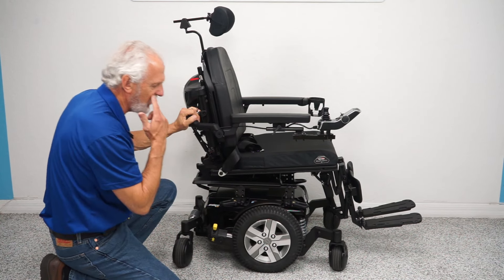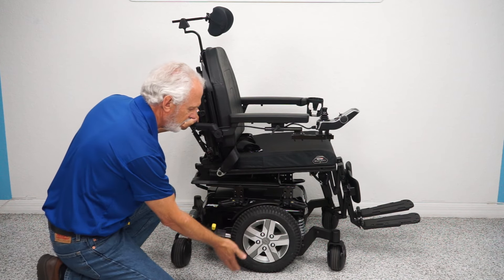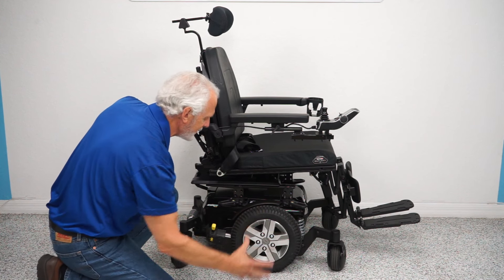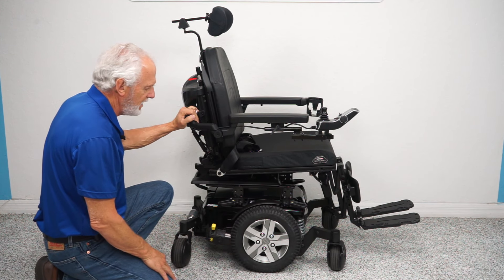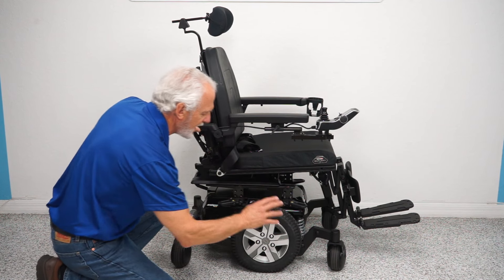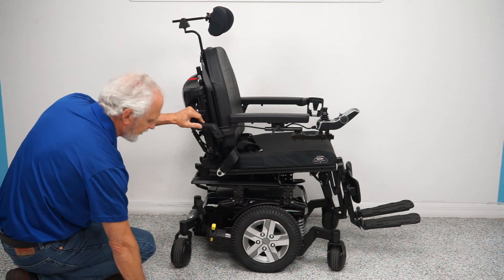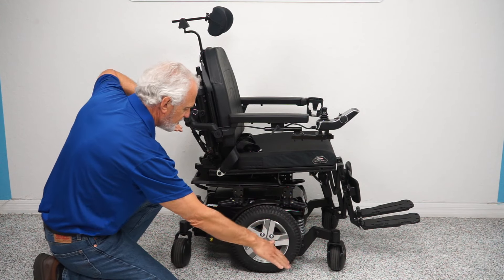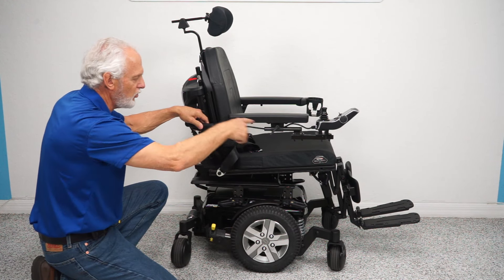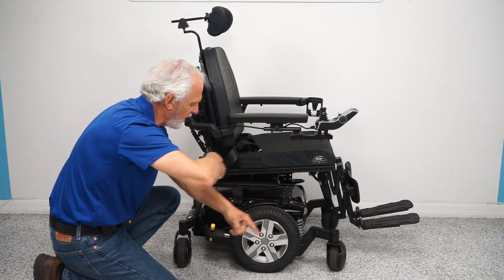Let's look at the base. This is a mid-wheel drive — your drive wheels, the big wheels, are in the middle of the chair. That gives you the best turning radius. With mid-wheel drive, you always have a wheel in front and a wheel in back on the ground, so the chair stays level. When you turn a circle, you'll see the wheels spin to keep the chair in the same spot.